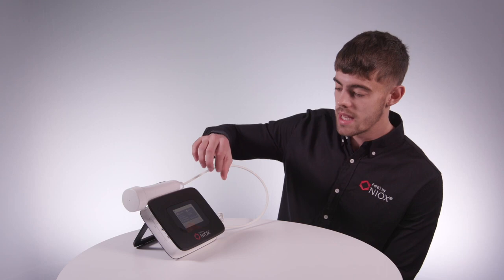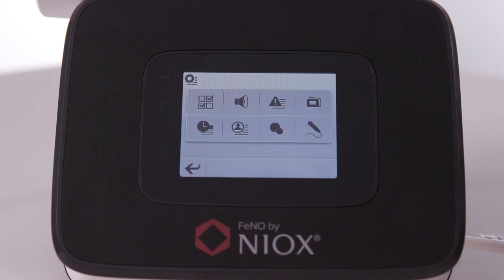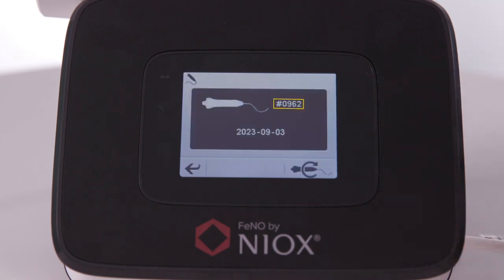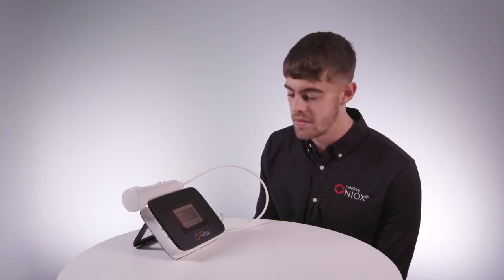To find the breathing handle details, select the back arrow in the bottom left, then the breathing handle icon in the bottom right. Here, you have the number of remaining tests on the breathing handle and the breathing handle expiry date. The breathing handle has an expiry date to help maintain the accuracy of the NARCS Vero.